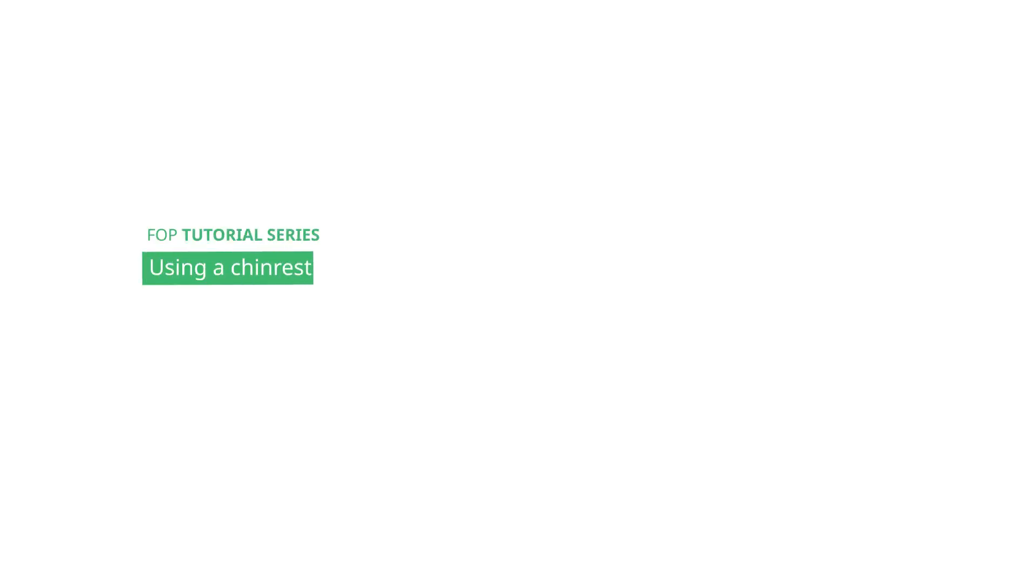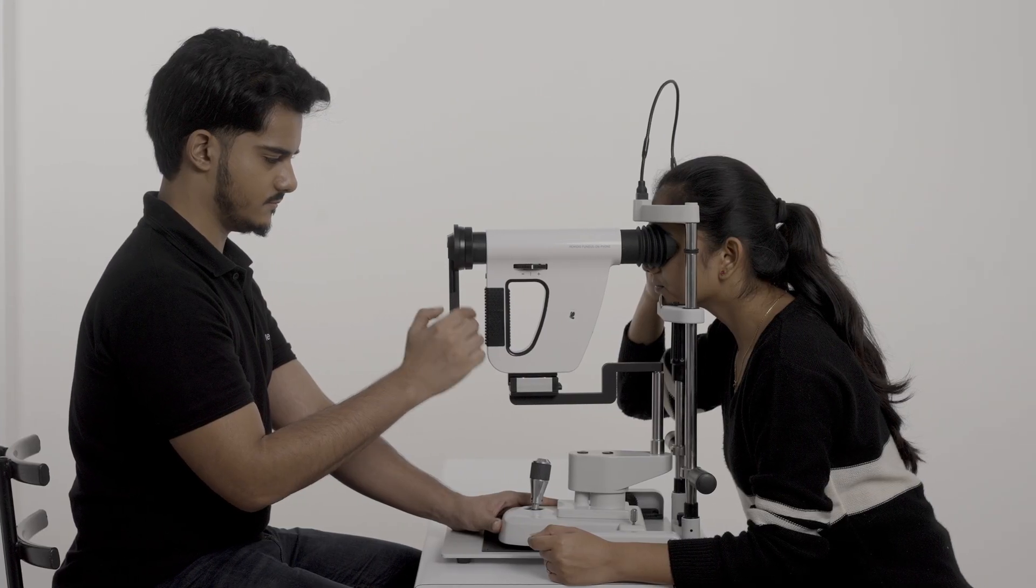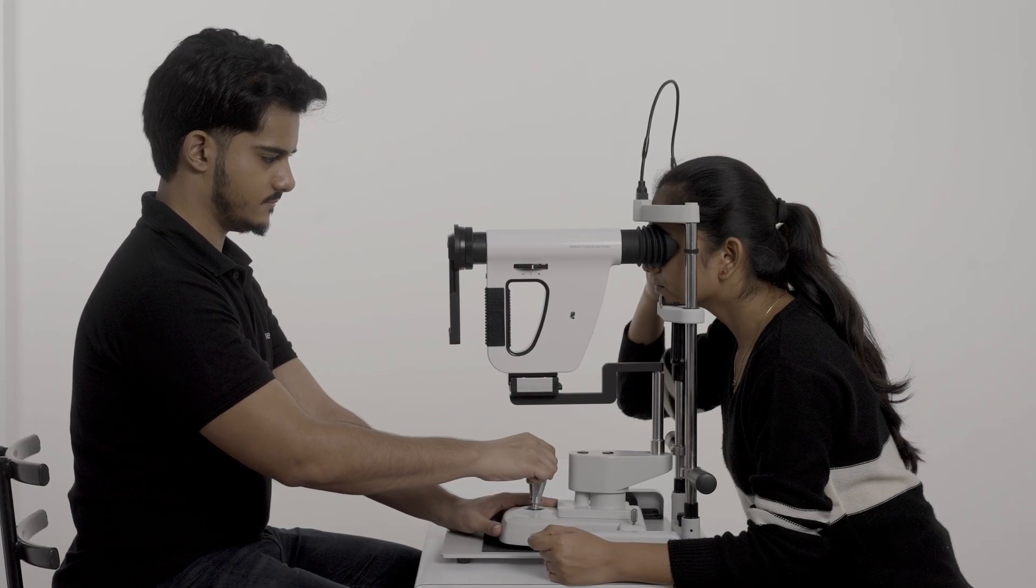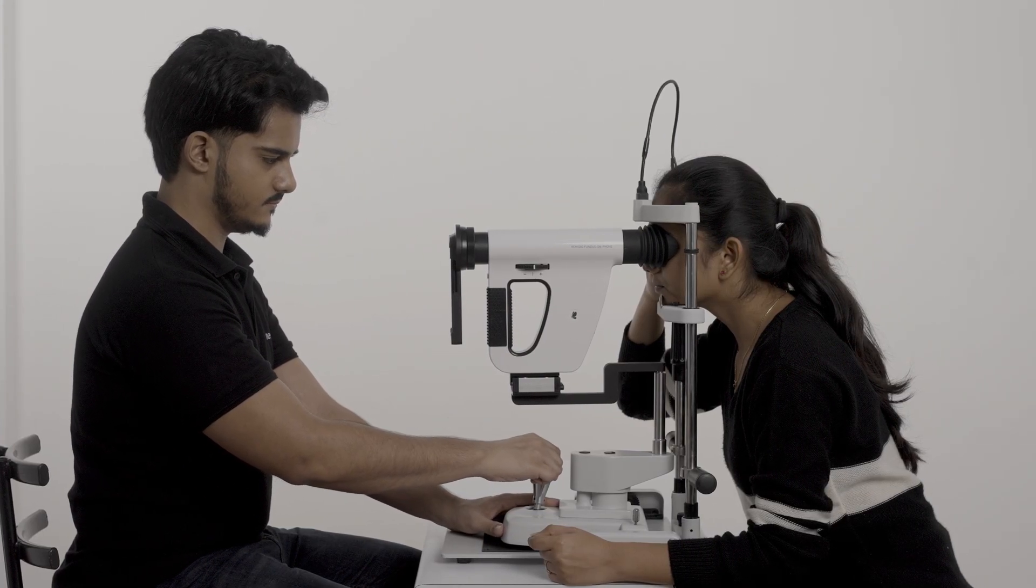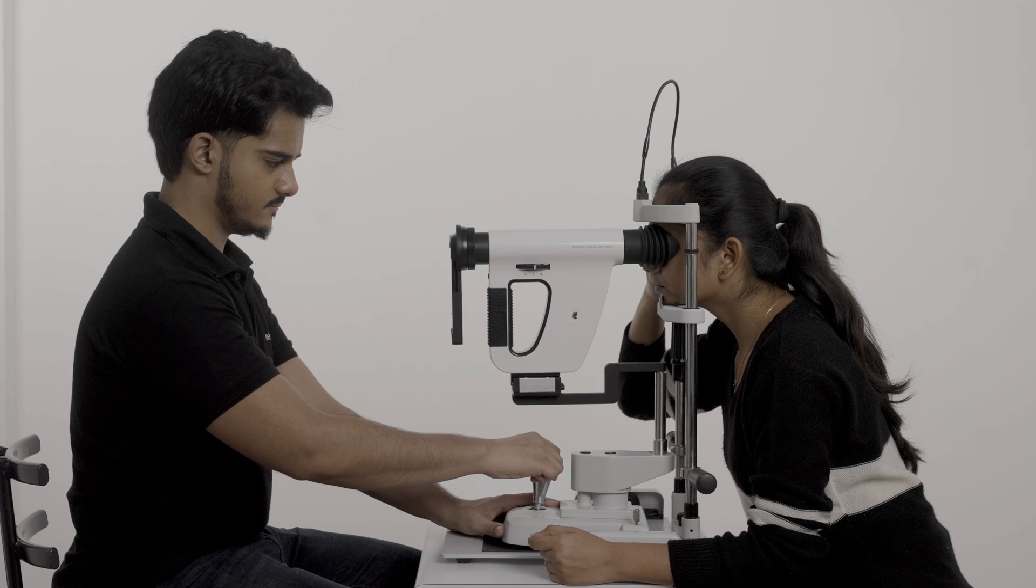The Remediu FOP can be used both as a handheld and tabletop device. Using it on a tabletop chin rest can improve stability while imaging.